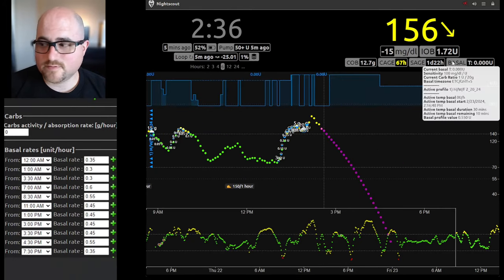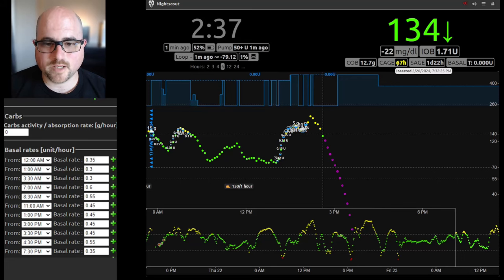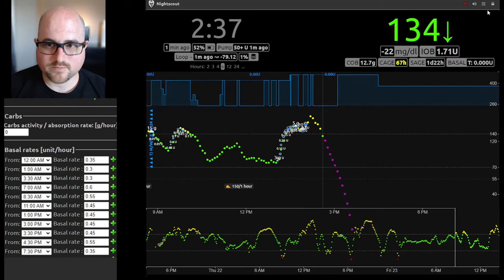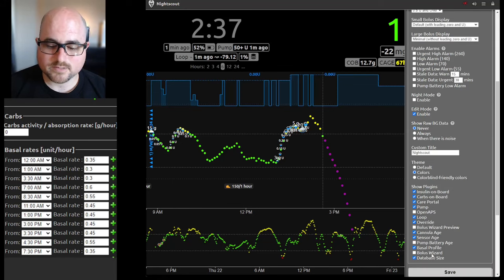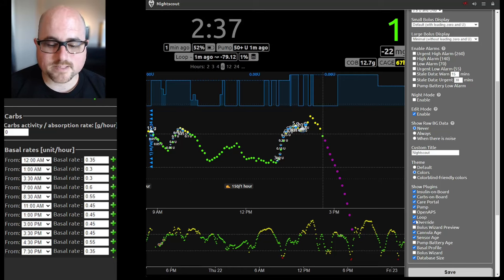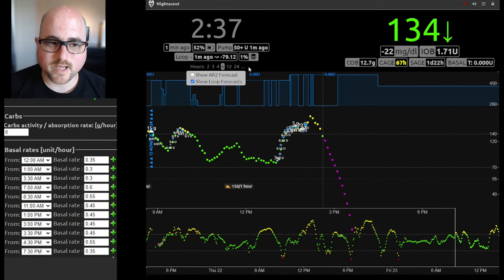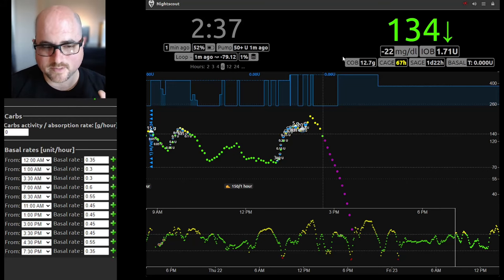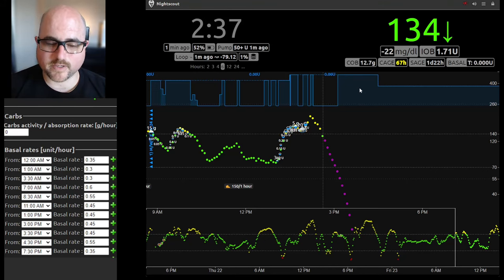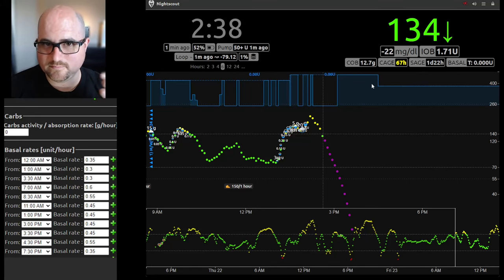We'll do a quick cursory glance, make sure all the basic stuff is available on the screen. So we have the loop pill, the CAGE is nice, SAGE is nice, IOB — all that's visible. Double-check the settings real fast. We have basal rendering — we all see the blue section here at the top going up and down. I have all the alarms turned off so hopefully they won't go off on us while we're looking at stuff. Insulin on board, carbs on board, care portal, sensor age, cannula age — all that's fine. Basal profile. The big thing is that you have loop enabled, override enabled, and that you have the loop prediction, which we see as this purple line here. Those are some of the basic settings you want when you're looking at your NightScout site. A lot of it is in your defaults. So if you use NightScout Pro or Heroku or something like that, you want to make sure your variables are set up so that when you launch this page, everything's where you want it to be.